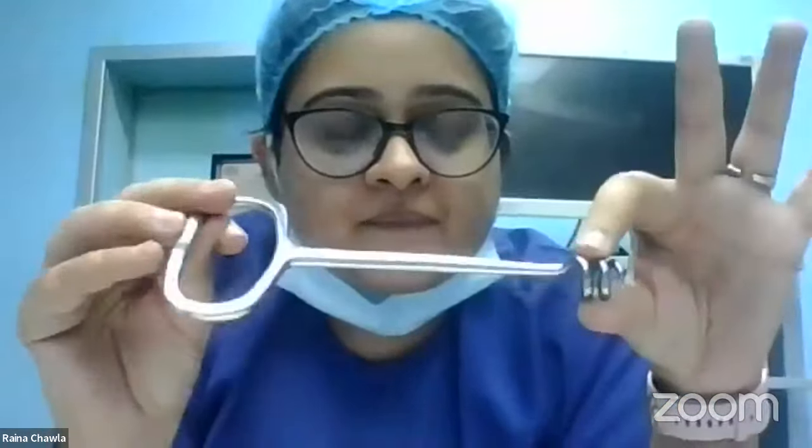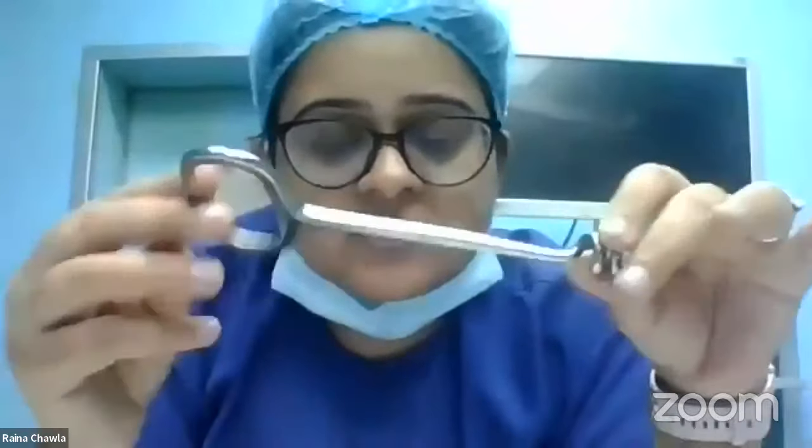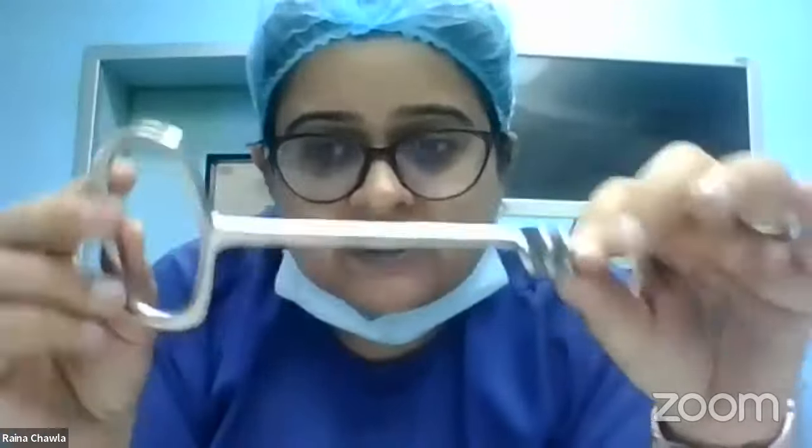Now coming to some more instruments. What is this? The Doyen's myoma screw. This is a Doyen's myoma screw. So a myoma screw is basically, you can see it, the end is like a screw. So what it is used for basically is myomectomies.